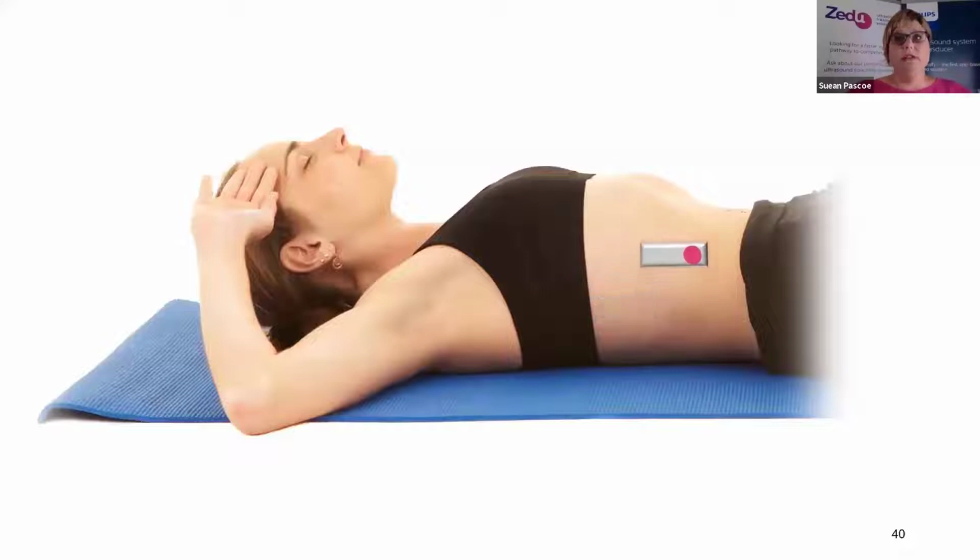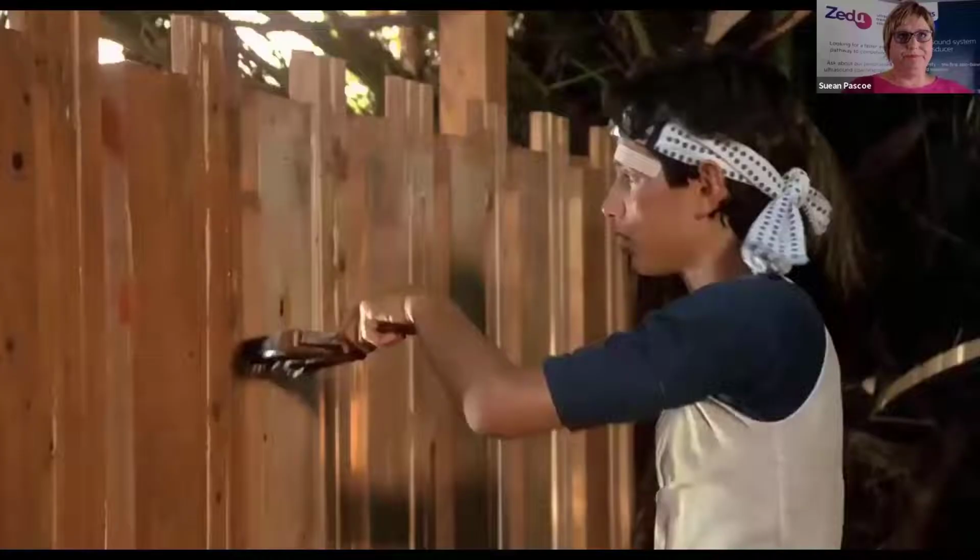What we need to do then is not go crazy hands-on and hope that we can find a view magically. I want you to be quite systematic and thorough and paint the fence. So we're going to go anterior and posterior, and then we're going to move up a rib space and repeat that, paint the fence again, anterior and posterior. That'll get me just under the diaphragm. And if we go up another rib space, we'll see the base of the lung. In doing this systematic search, we need to assess the whole area, not just plonk the probe on and hope that it's right. We want to systematically search for a good window.